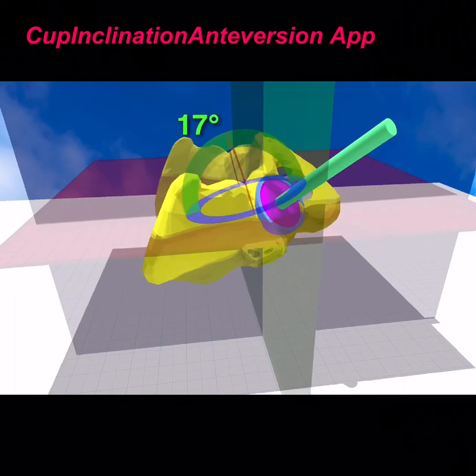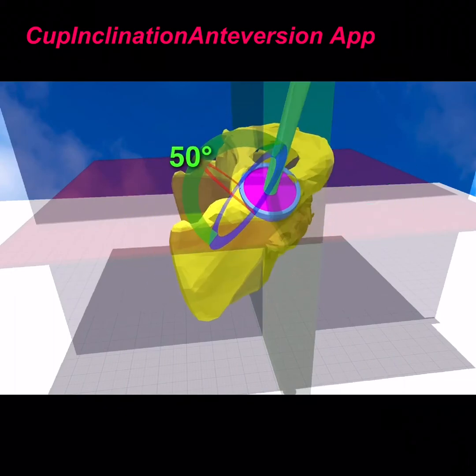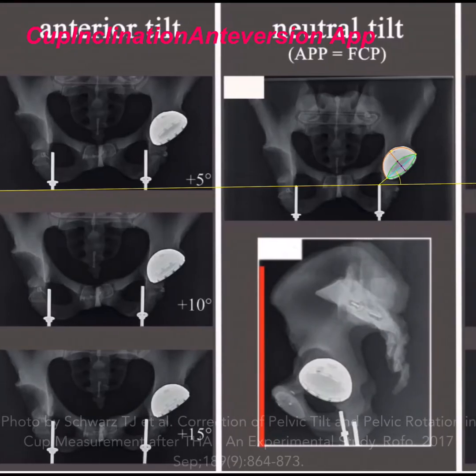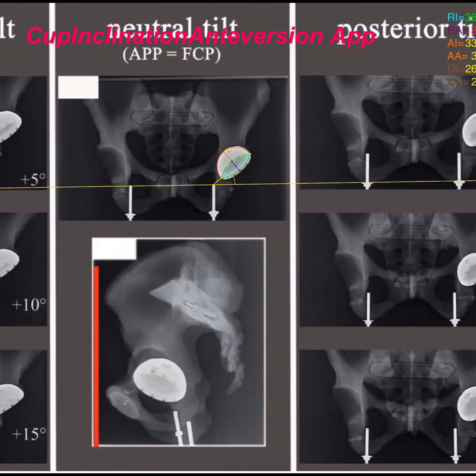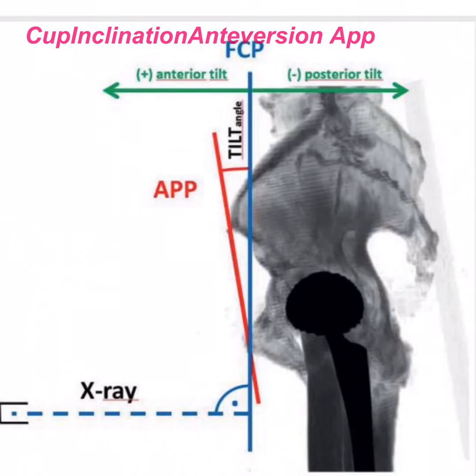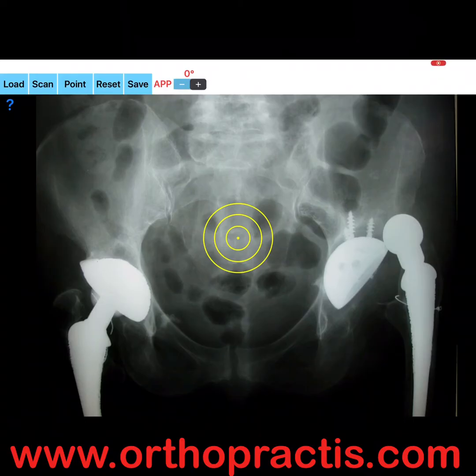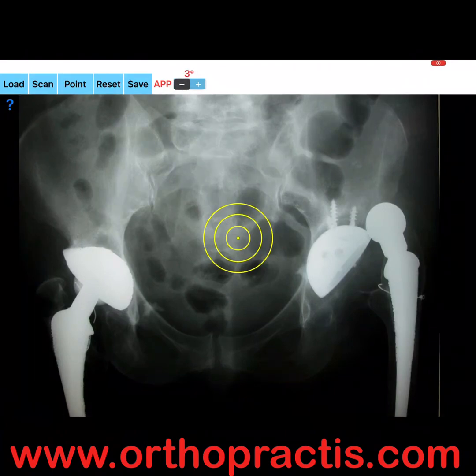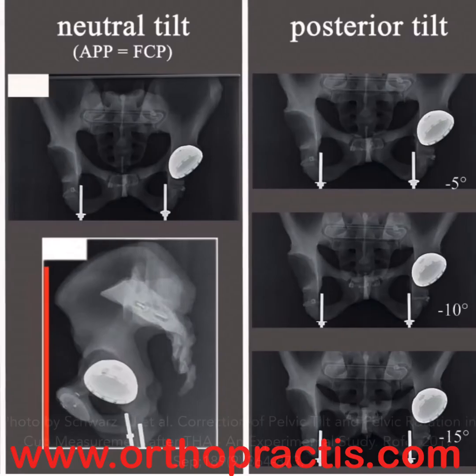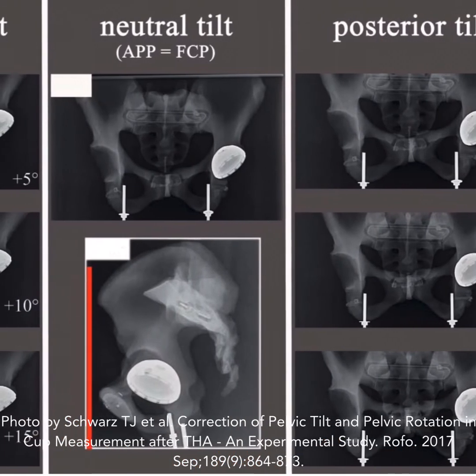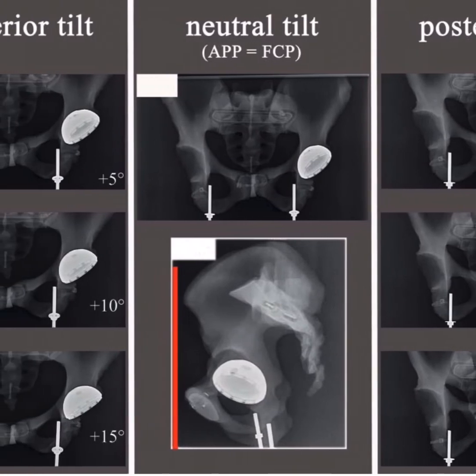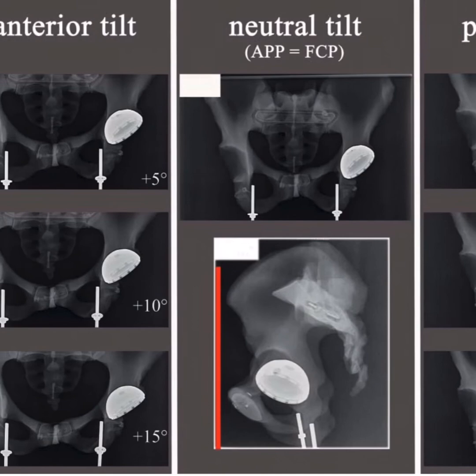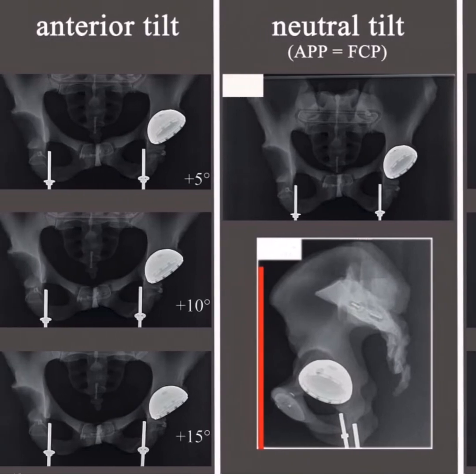Pelvic tilt may lead to misinterpretation of cup position on anteroposterior pelvic radiographs. The APP angle is added in calculation and can be adjusted manually according to the surgeon's preference. In case pelvic tilt measured by APP angle is known, by pressing the plus or minus button the preferred angle, either negative or positive, can be selected. A negative angle indicates posterior pelvic tilt; a positive APP angle indicates anterior pelvic tilt. Otherwise the APP angle takes by default a zero value.